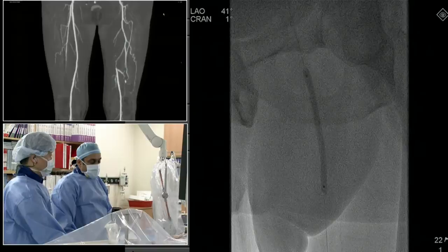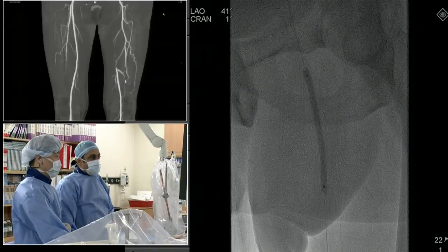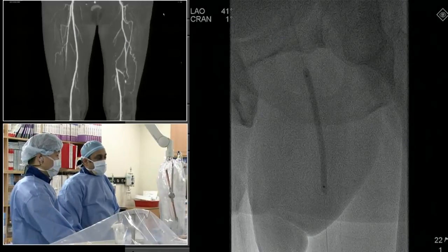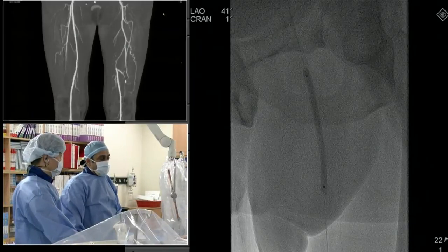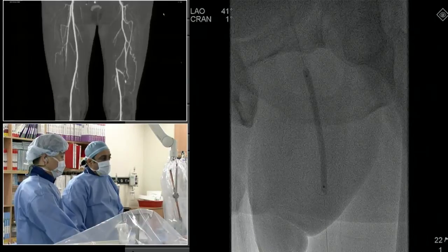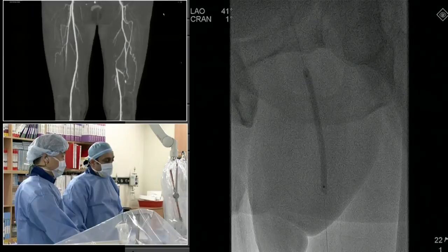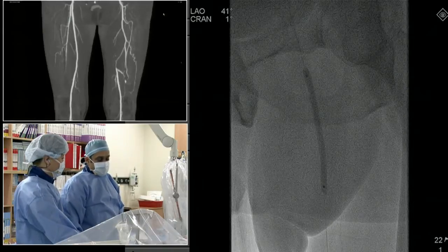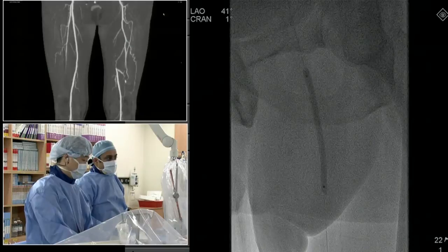Yeah, you know, you're absolutely right. And this was done more just to, I guess, showcase a particular strategy. I don't think this is a viable strategy at this point, at least for most hospitals in the U.S., even once DV gets available. The cost of an atherectomy device plus a filter, which is debatable whether to use one, plus a DEB is prohibitive. Maybe our industry partners will consider bundling or have some kind of strategy that will not be so expensive. But at least for now, I don't know if this is something that's doable on a regular basis.